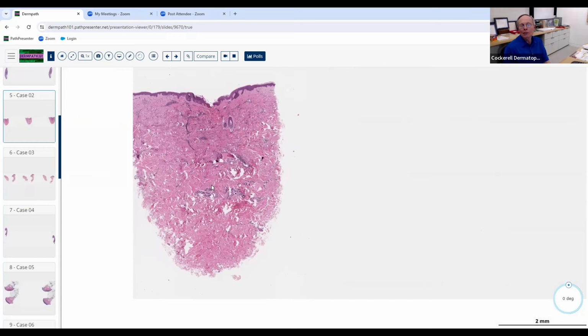Normally, if you take a punch biopsy from somebody's skin and you pull it out, you've all seen that in clinic, it kind of retracts. You've got a lot of elastic tissue in your skin, and so it usually forms almost like a little figure eight. It contracts a little bit, even if you don't squeeze it. We obviously implore you not to squeeze the biopsy because it's crush artifact, but usually there's not this square morphology.